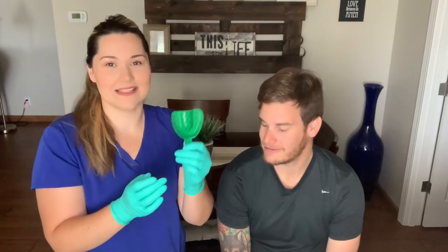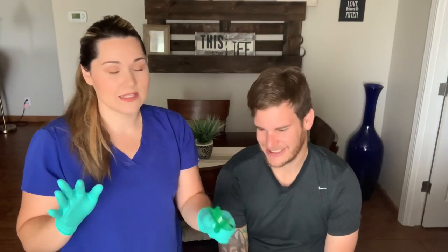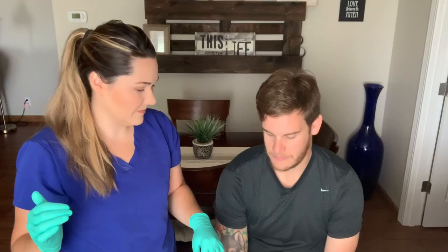The top impression is the hardest for most people because when you fill up the tray the alginate will leak out the backside and down the throat, so if someone has a bad gag reflex this is the one that causes the most trouble. You can start with the bottom to give them a picture of what it'll be like, or if they want to get the hard one out of the way, you can do that. He wants to do the easy one first.